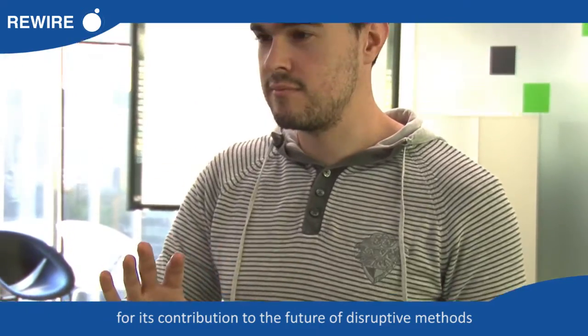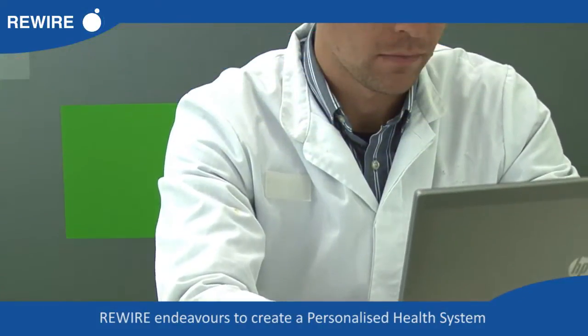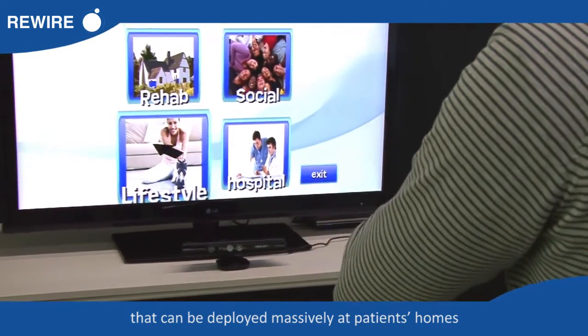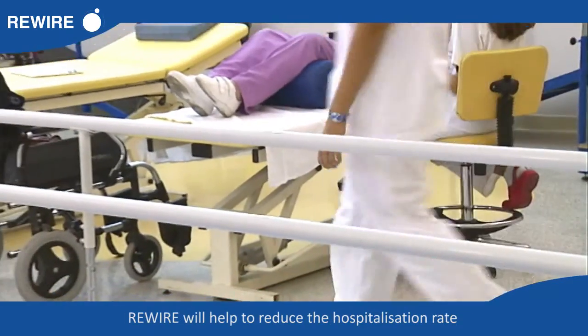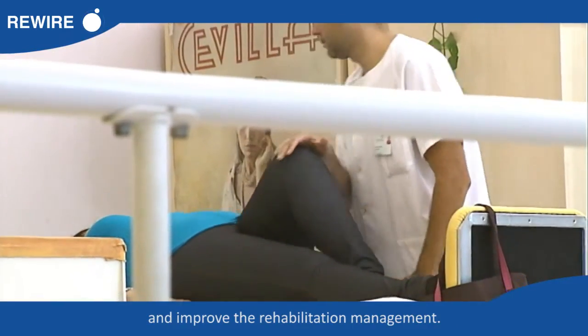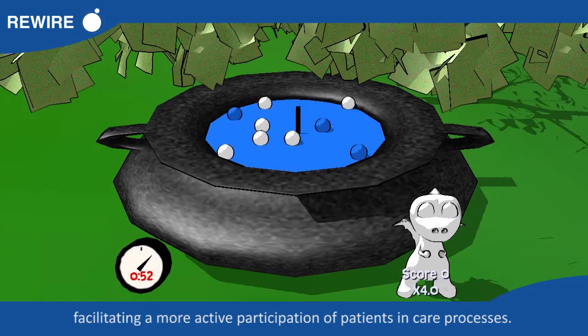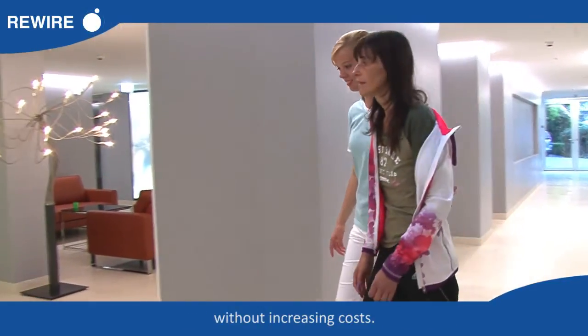During the project execution, REWIRE has raised considerable interest among stakeholders for its contribution to the future of disruptive methods for teletherapy systems. REWIRE endeavors to create a personalized health system that can be deployed massively at patients' homes, enabling home-based effective rehabilitation to improve disabilities and functions. REWIRE will help reduce the hospitalization rate, improve rehabilitation management, and improve interaction between patients and doctors, facilitating a more active participation of patients in care processes. Thanks to REWIRE, health services will be able to assist more people without increasing costs.